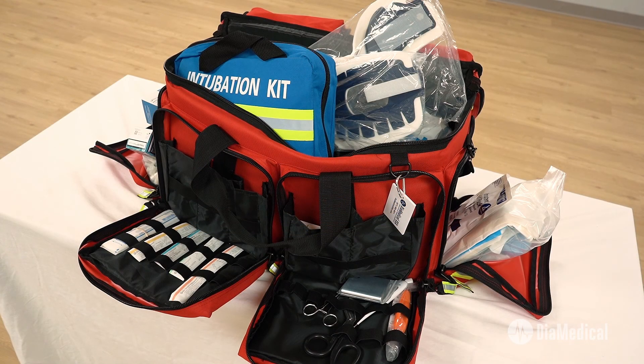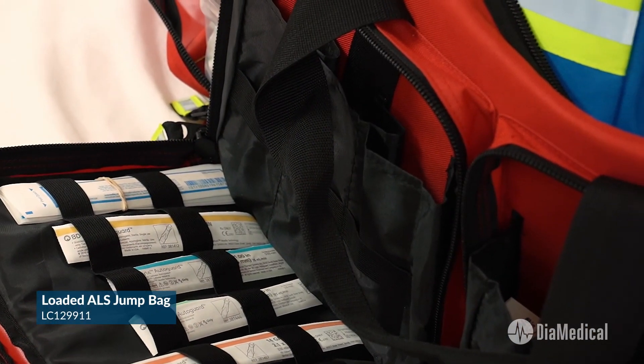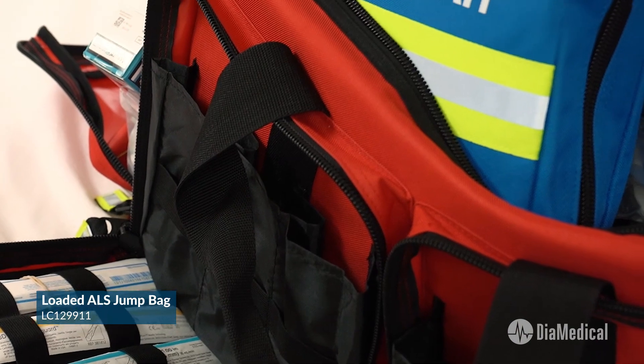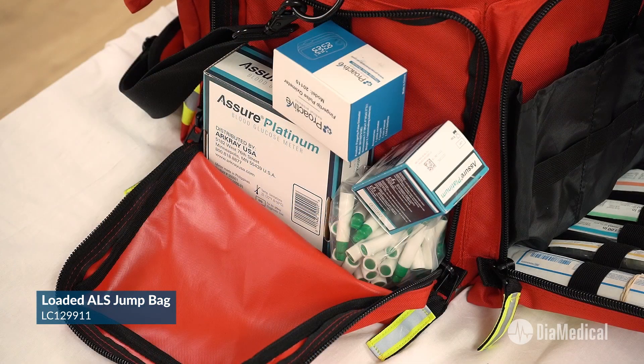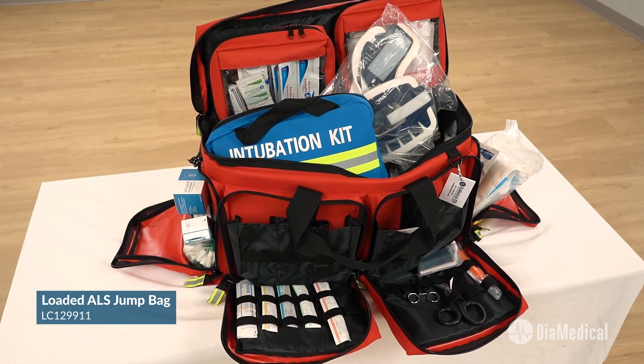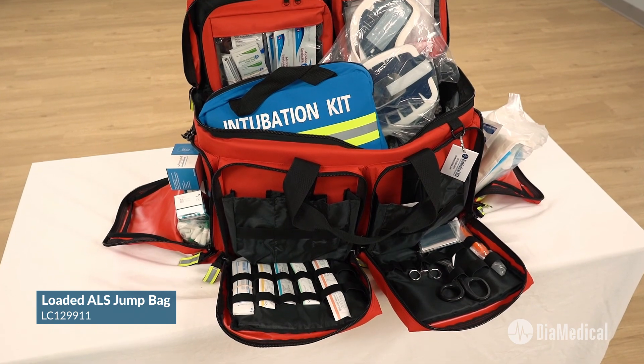The red SimLab Solutions Loaded Training ALS Jump Bag is designed for training paramedic students how to perform advanced life support skills. It contains all of the supplies that are included in the BLS bag, along with equipment for intubation, cricothyroidotomy, and IV access.